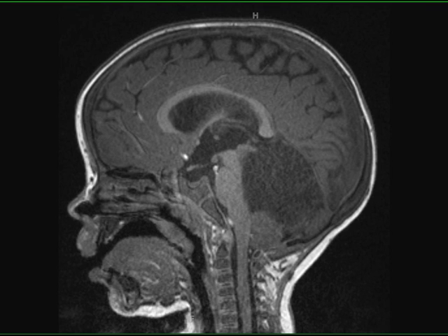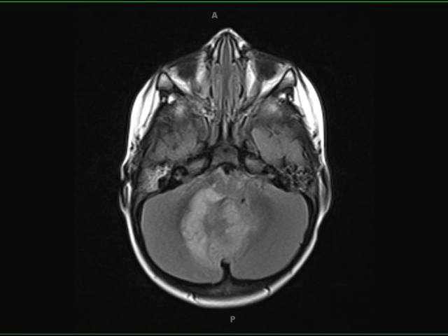This is a case of Lermit-Duclos disease, also known as dysplastic cerebellar gangliocytoma. The images demonstrate an infiltrative T1 hypo-intense, T2 FLAIR hyper-intense lesion centered within the vermis and right greater than left parasagittal cerebellum, with associated gyral swelling and effacement of the fourth ventricle.